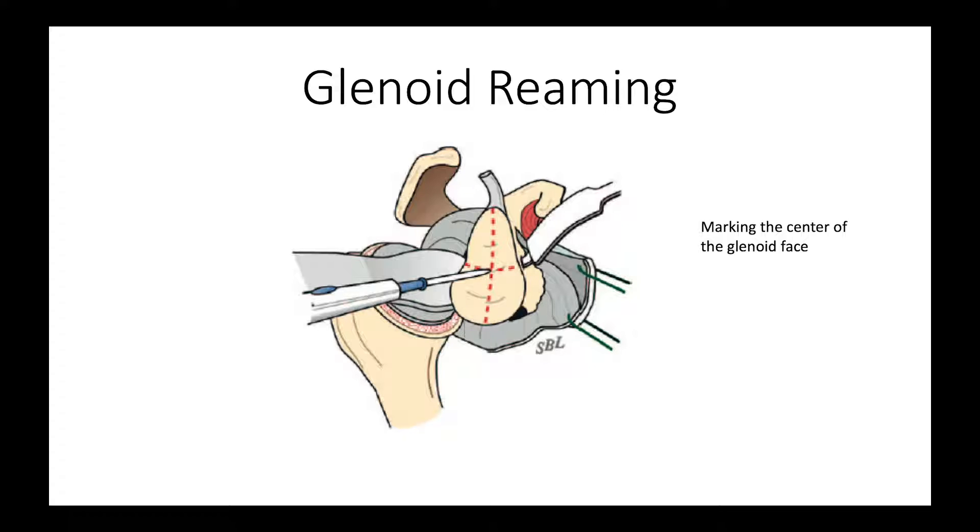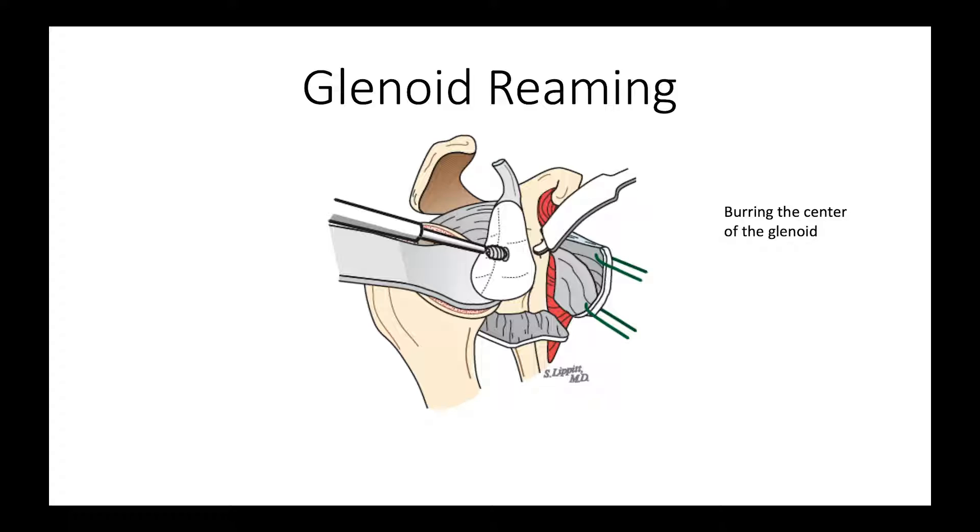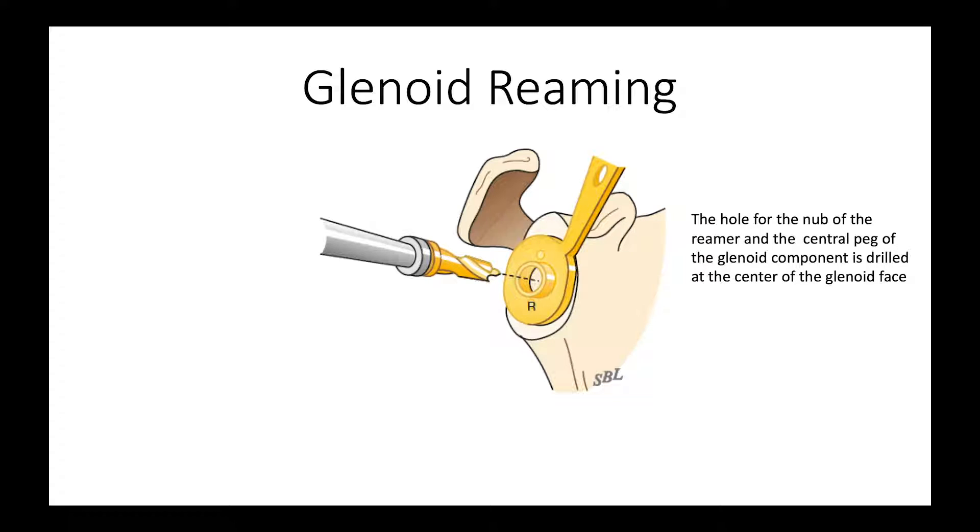Then we get ready to ream the glenoid and we mark the center point of the glenoid. We then make a little hole with a pinecone burr to stabilize the drill, and then take a drill and drill through that hole perpendicular to the face of the glenoid.